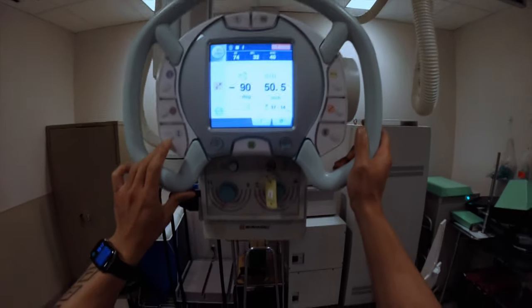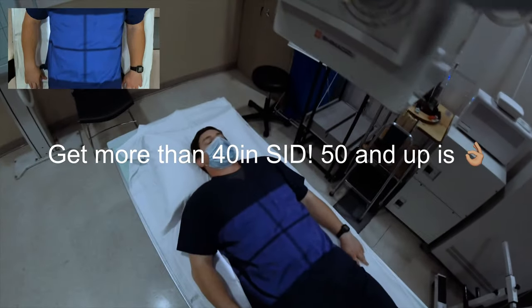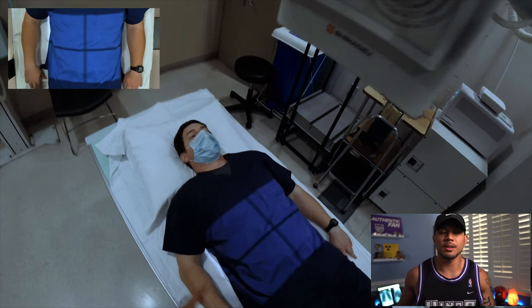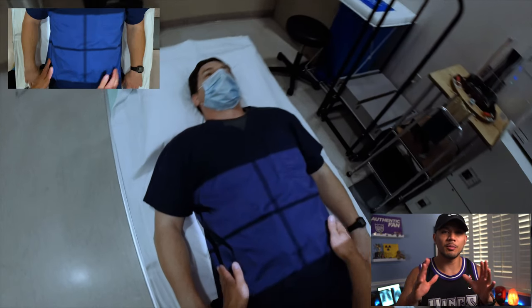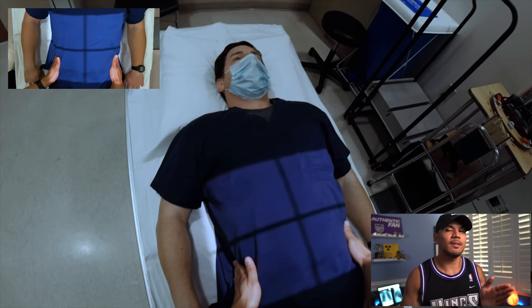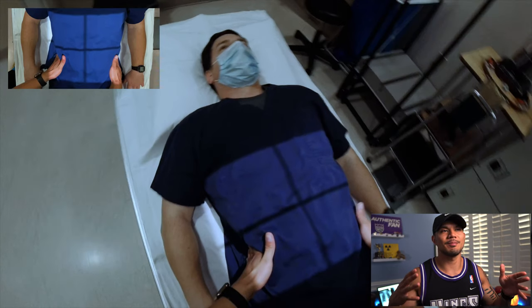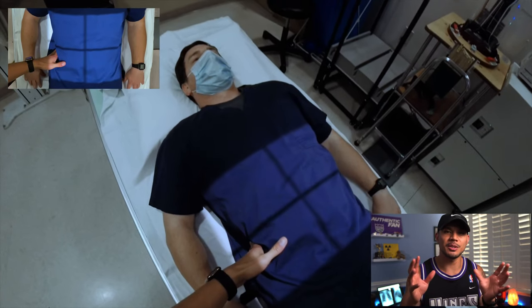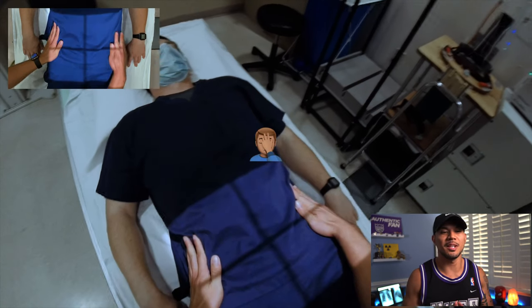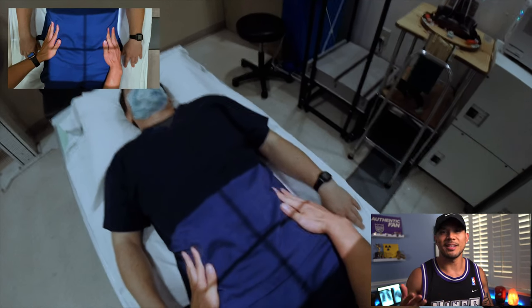Okay. All right, any surgeries, any previous injuries, anything like that? No. All right, so we're going to take a picture of your full pelvis and then just... So right here, I tell the patient we are taking an image of the full pelvis because you have no idea how many times, or maybe you do, that when I'm feeling for the right side of their crest, they say, oh, it's the left side. I'm like, I know, but I need to take a full picture of the pelvis. So just to save yourself a shake my head, a palm to the face moment, I always let my patient know that we are taking a full picture of the pelvis, so I don't have to hear that.